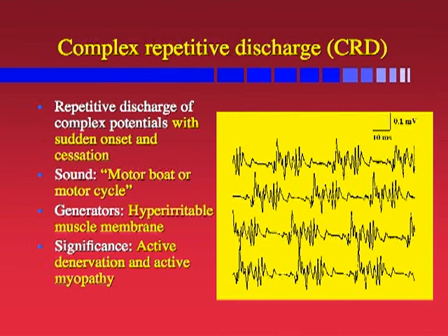CRD is usually an expression of hyperexcitable muscle membrane. CRD, though impressive in the needle EMG, is not associated with any clinical counterpart. On rare occasions, CRDs may be observed in isolation in normal paraspinal, iliopsoas, and sphincter muscles. In pathological states, CRDs are usually associated with profuse fibrillations and PSWs, regardless of diseases. On many occasions, the generator can be accurately pinpointed because with a minimal needle movement from the generator, CRDs will cease firing. Watch and listen to CRDs.